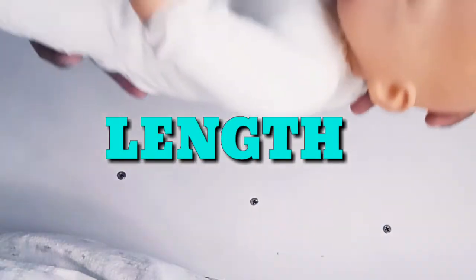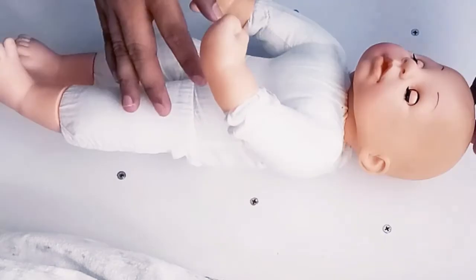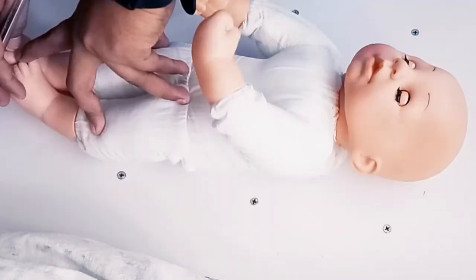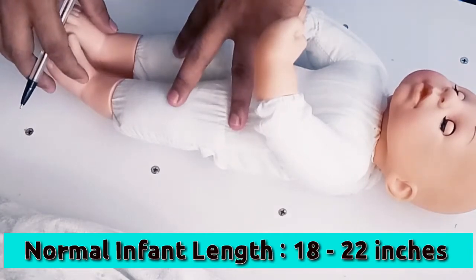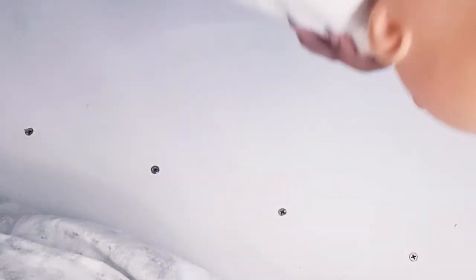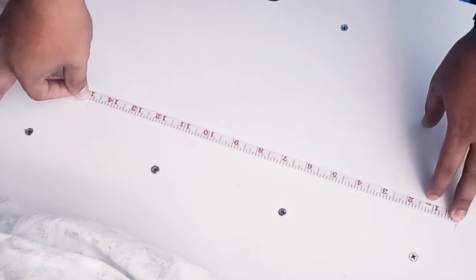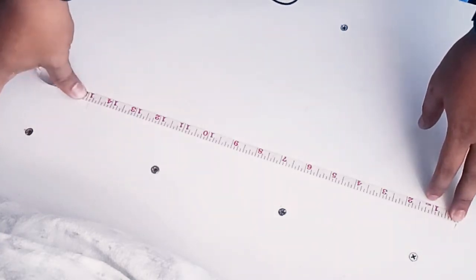To measure the length, lay the infant on a surface that you can mark. You need a marker or pen. If it's difficult because the baby is moving, ask for help. We're going to measure from head to heel — mark here at the head, then extend the leg outward and mark at the heel. A normal length of an infant is about 18 to 22 inches. After marking, gently lift the baby up and measure the length using a measuring tape. The infant is 22 inches from head to heel.